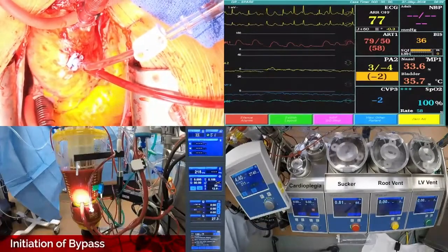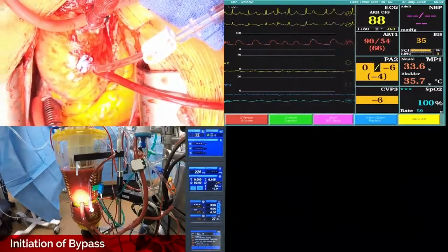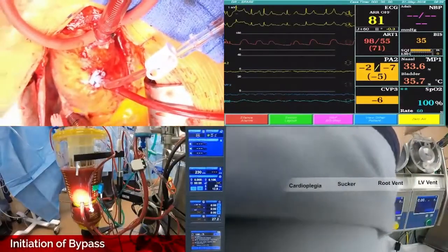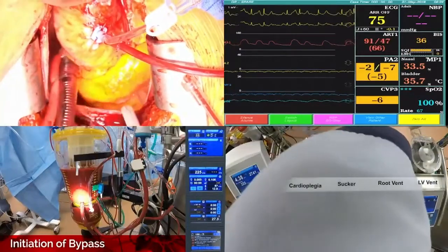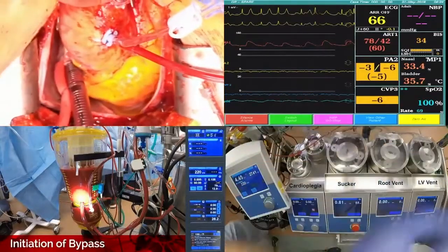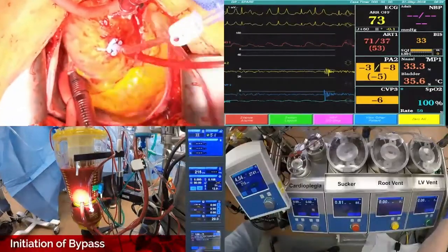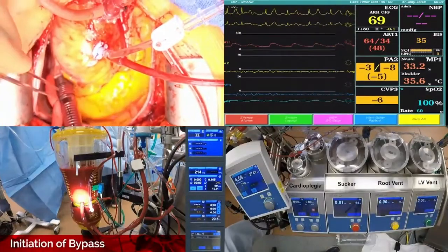Here, watch, Patrick. You're going on pump. I'm not the perfusionist here. But look at the heart getting smaller, and look over on the right. You'll see the pressure starting to drop down, and it should become continuous. The aorta's not thumping either. And you see the reservoirs going up. You can see the venous blood and the color difference. Look at that, there's flow right there at 4.5. And your pressure monitor. You want to go over some of that stuff, Patrick?